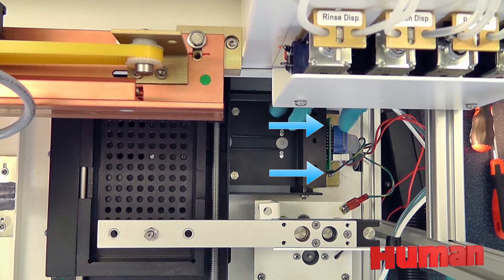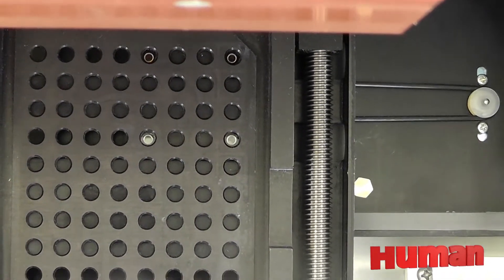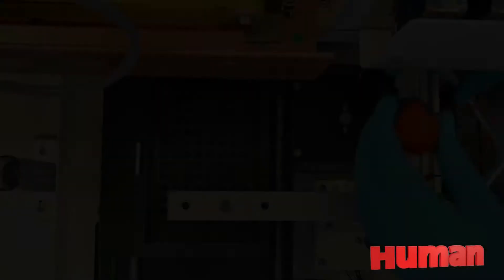unscrew the two screws that hold the photometer base to the floor of the plate XY. Move the photometer until the channel block lenses are centered to the holes. Once aligned, tighten the screws.